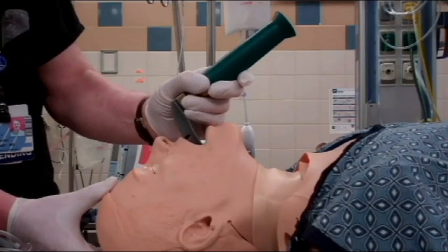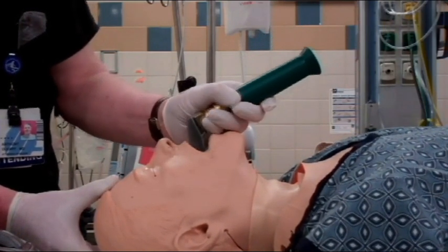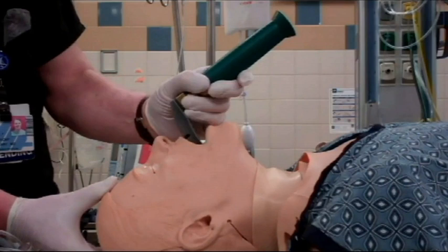You will see the tip of the epiglottis, then relax tension on the laryngoscope handle and carefully advance another half an inch or 1 inch depending on the size of the patient and lift diagonally upwards a second time. The second lift allows the epiglottis to be elevated and reveals the true vocal cords.